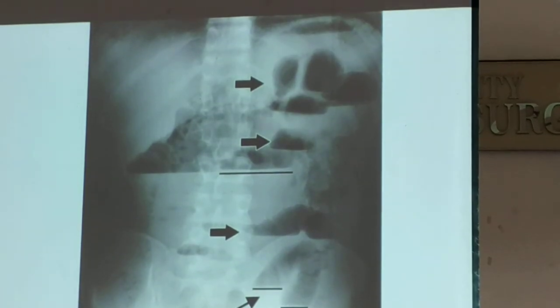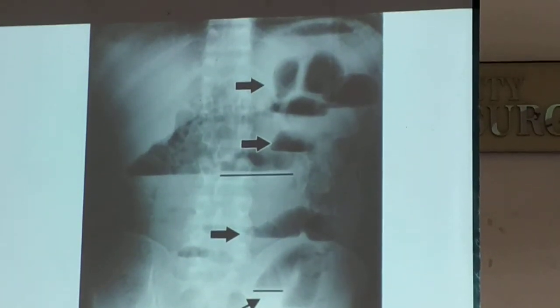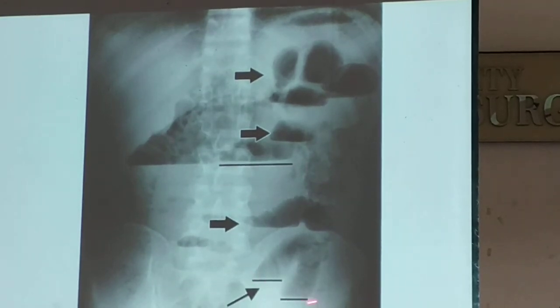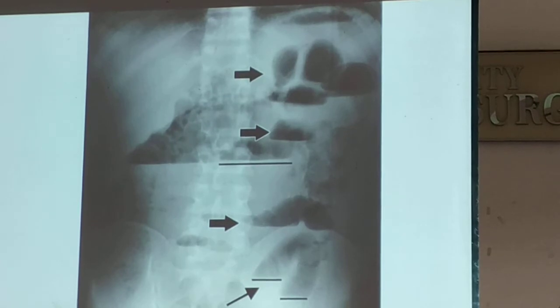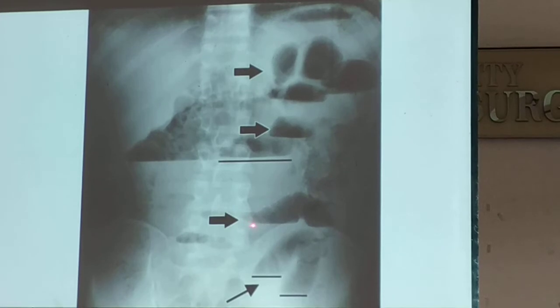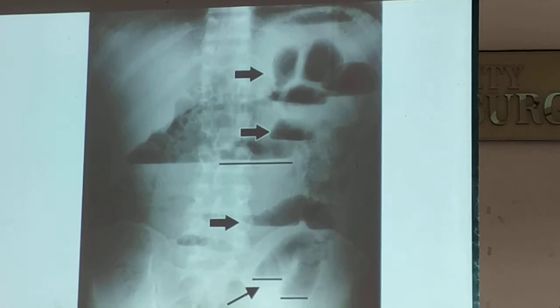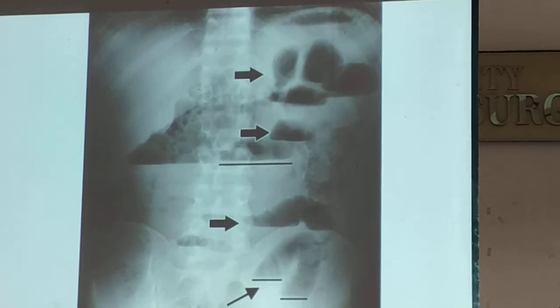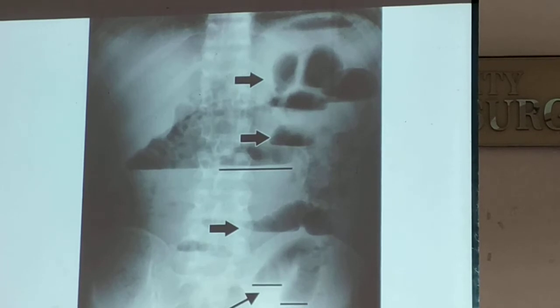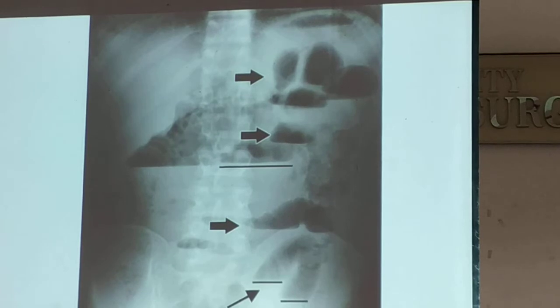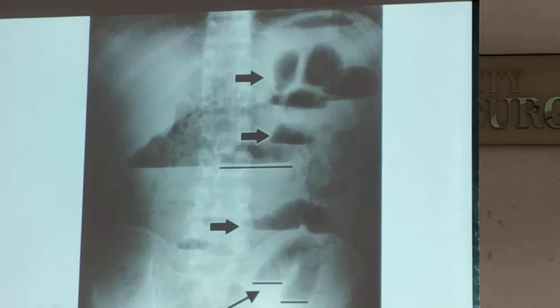The more prominent air-fluid levels form the typical step ladder sign — like the steps of stairs, you step higher and then there is another line, you go higher. That is why we call it the step ladder sign. This is seen on an upright film because you do not see air-fluid levels on a supine film.